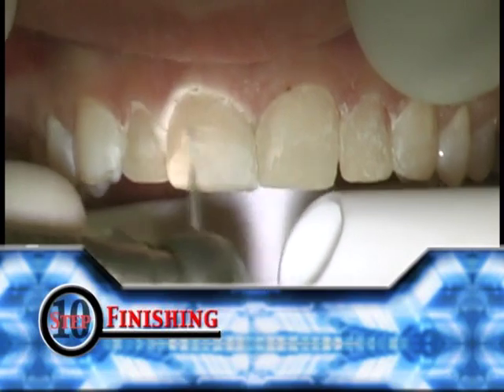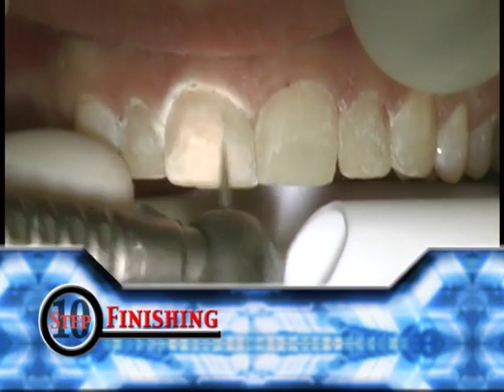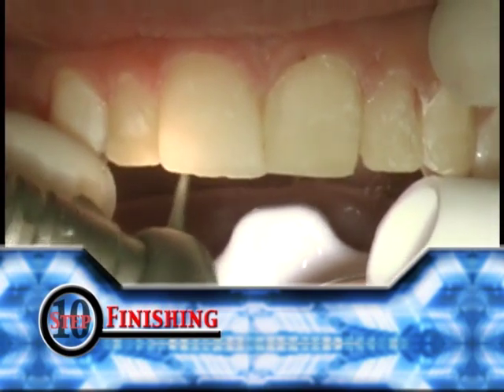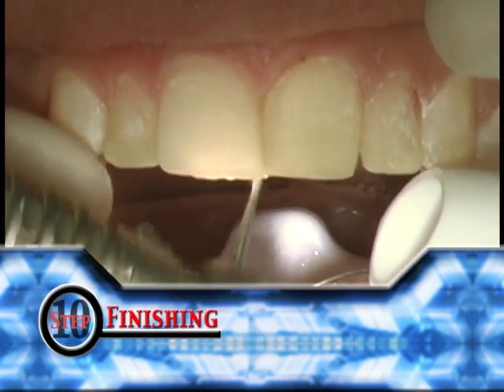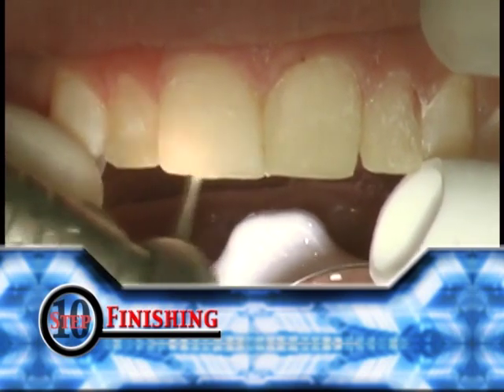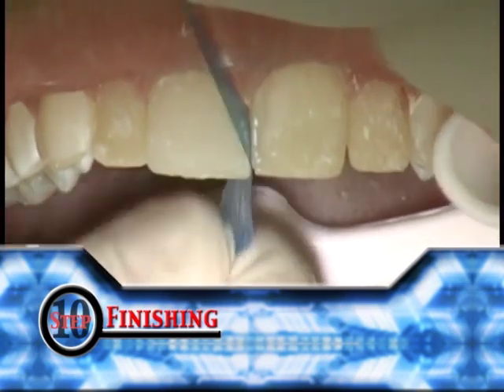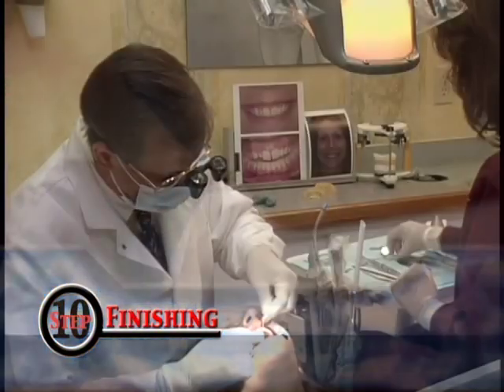Finish by trimming and polishing the tooth to remove the air-inhibited layer so that nothing placed on adjacent teeth will stick to our new veneer. You'll also want to create a slightly less than perfect edge to look more natural. Check for good contact and assure that the interproximal areas are not stuck together. After that, use the thinnest sanding strip possible. We're using Epitex. Never use a metal sanding strip for this step.